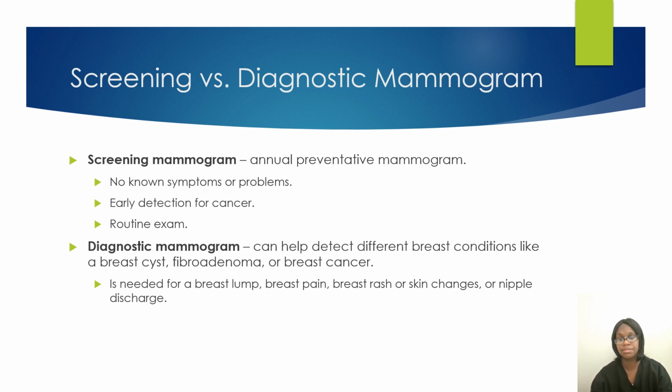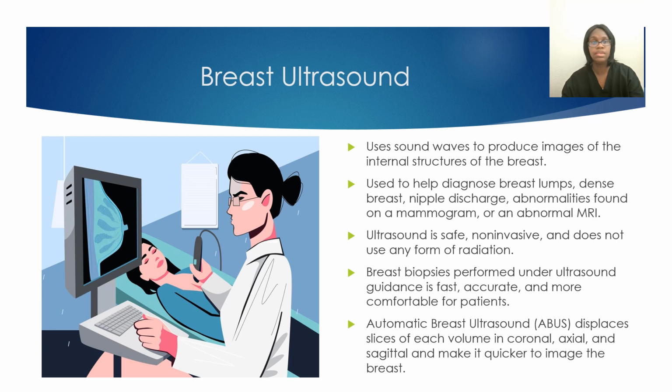Your diagnostic mammogram is going to detect cancer, a cyst, or a fibroadenoma, and explain why a patient may have a lump, or why they are having breast pain. Most of the time, this is added on with a breast ultrasound.